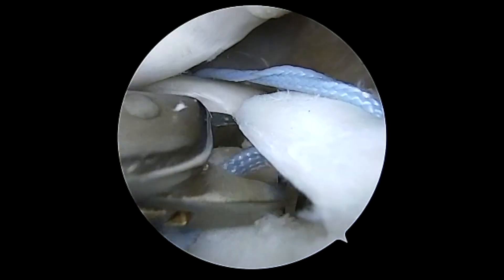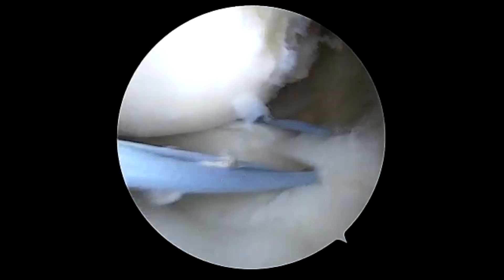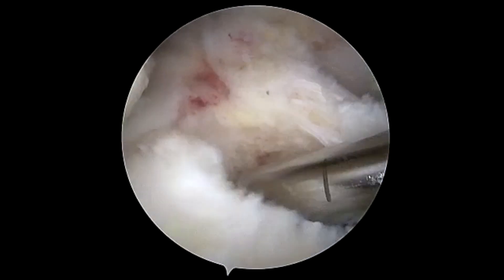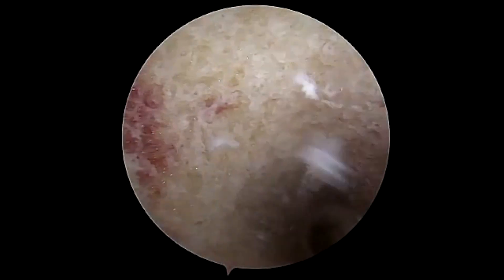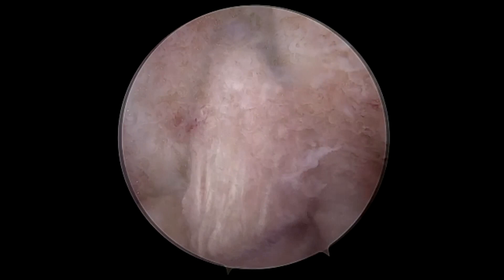You can see here we've got an excellent trajectory. We'll pass a passing suture through the cannulated metal sleeve of the Smith & Nephew guide. You can see that we can pull this meniscus together well and decrease the hoop stress. We then drill our tibial tunnel and leave the metal sleeve of the Smith & Nephew guide system in place to avoid truncating the sutures. You can see we have not penetrated and crossed our tunnels.